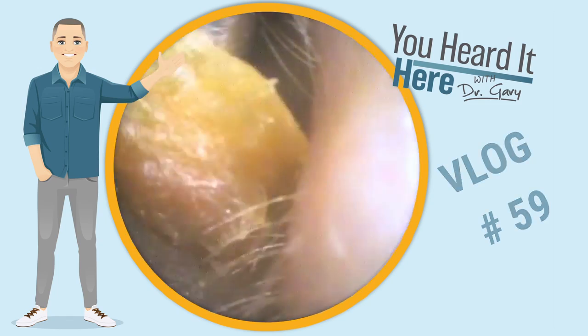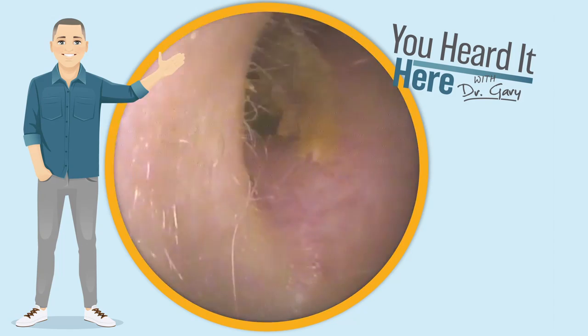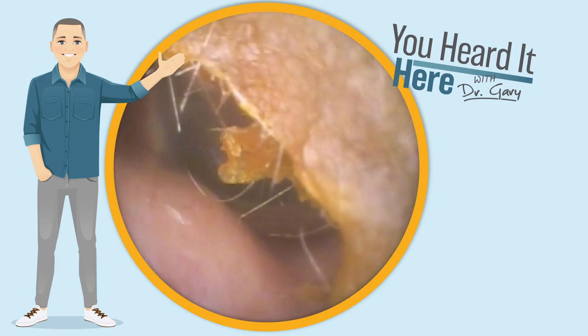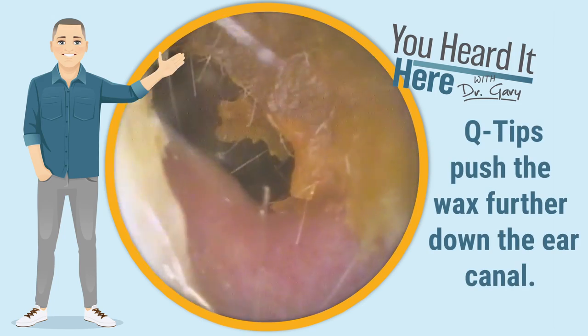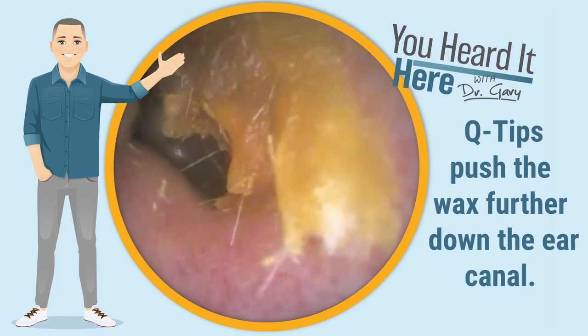Today we're going to take a look in an ear that's full of dead skin, earwax, and some hair. This patient, like many of my patients, is definitely a Q-tipper, as we can see by this wax being pushed so far past the second bend of the ear canal.